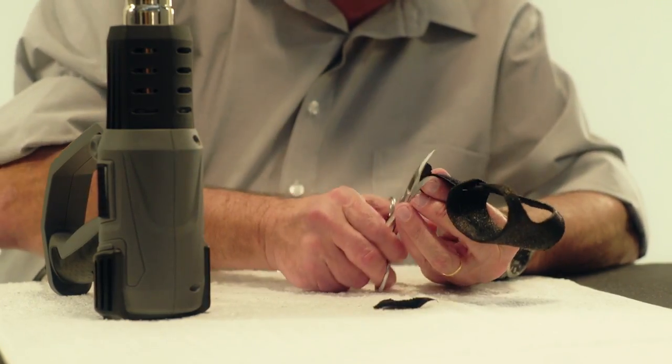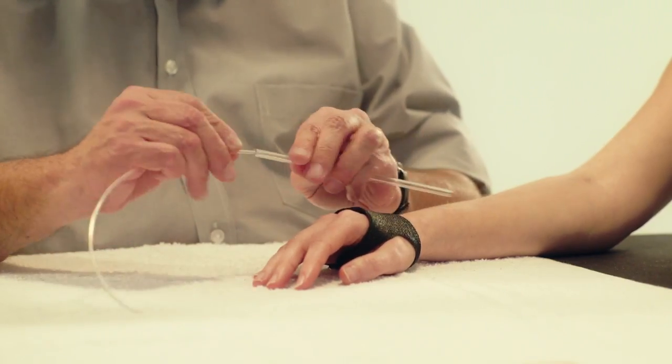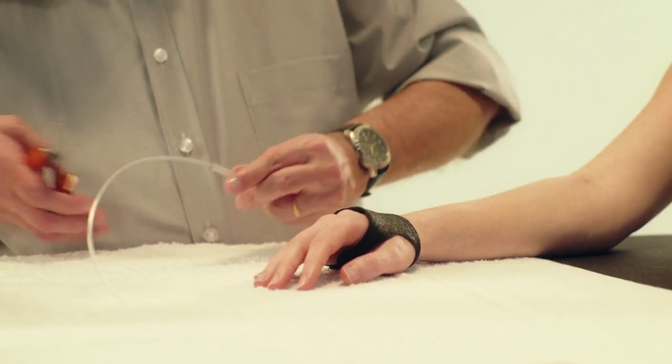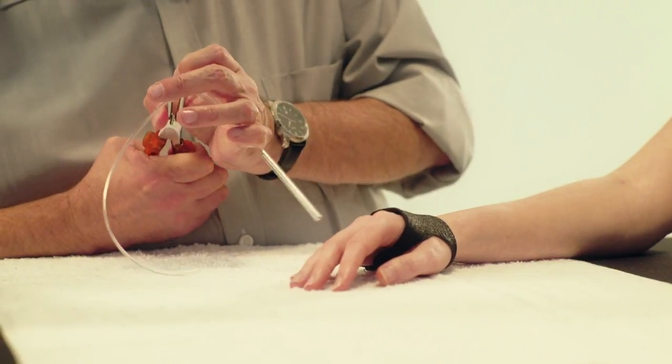We can now begin fabrication of the dynamic portion of the orthosis. Take an Orphi tube and slide the guide inside. Always bend the Orphi tube with the guide so that the hole is maintained.